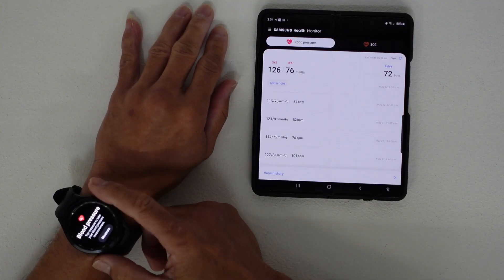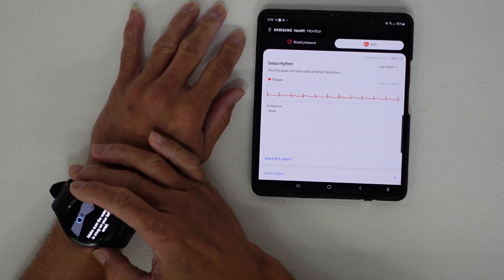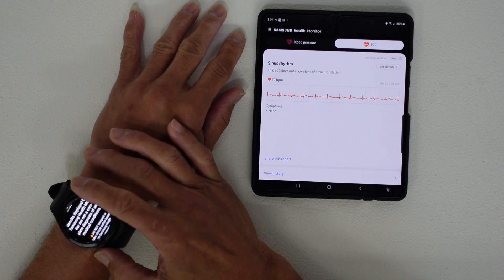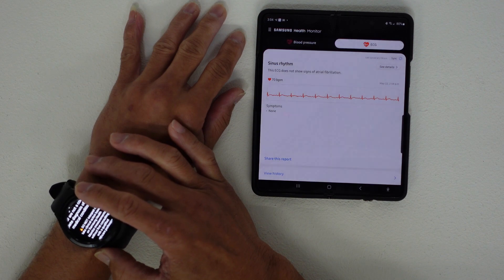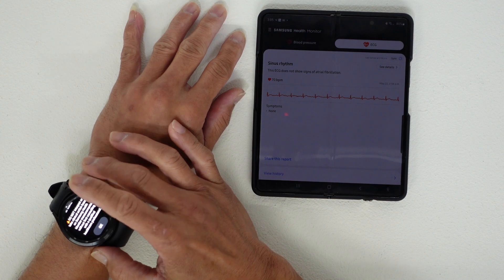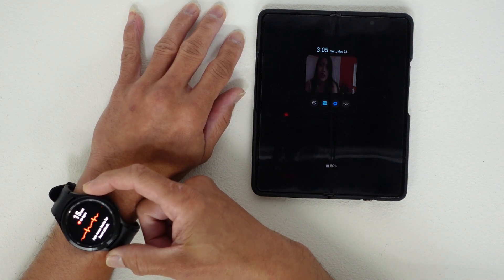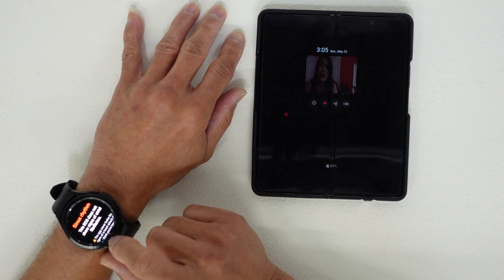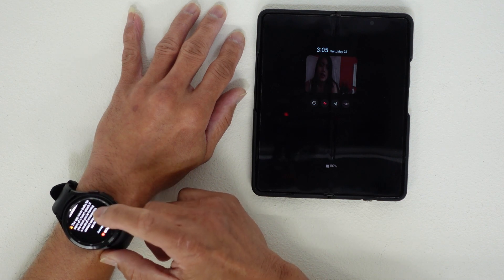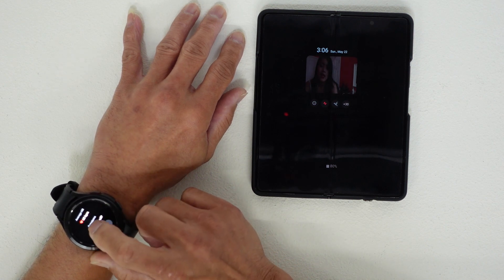Next, we check the ECG feature. Make sure the watch is snug on your left wrist. The app reminds you that results are not a complete diagnosis and to consult a qualified healthcare professional. Press the button and place your pointer finger lightly on the sensor. The result shows sinus rhythm — this ECG does not show signs of atrial fibrillation. The average heart rate is 68 beats per minute.